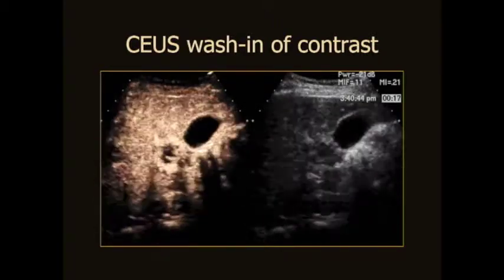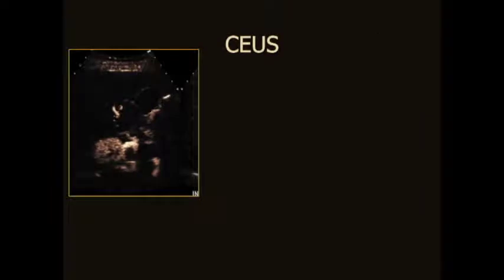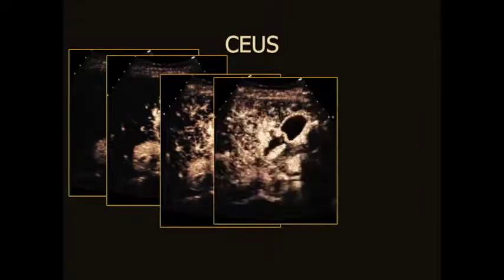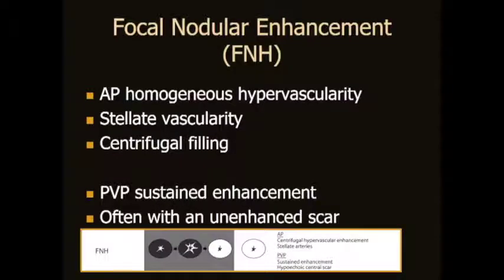This is the one lesion where we tend to move around a bit to enhance our capability to show the peripheral puddles. And so we can again extract these excellent images showing those peripheral puddles progressing towards centripetal and ultimately complete enhancement, a classic hemangioma.